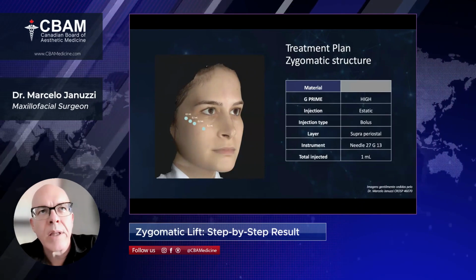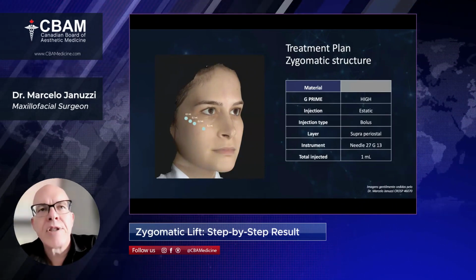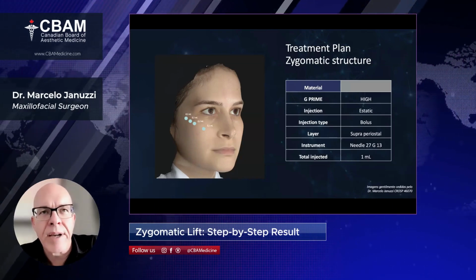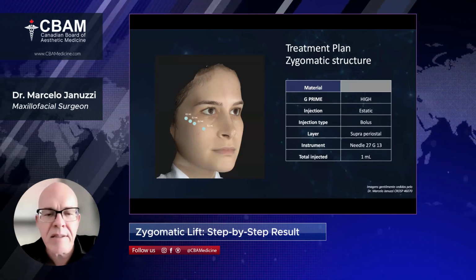So when we touch the bone, we need to aspirate to guarantee that we are not inside some vessel and avoid hyaluronic acid injection inside the vessel.